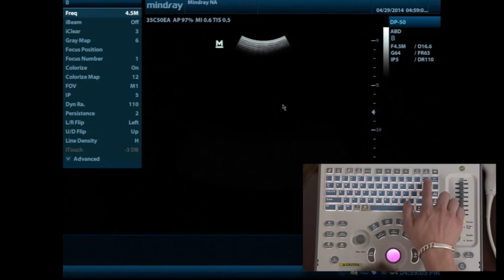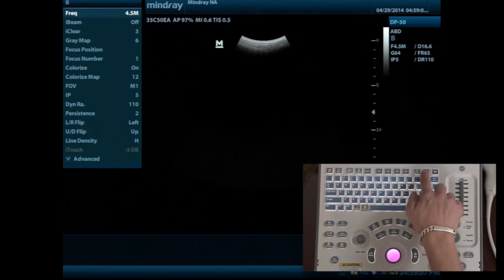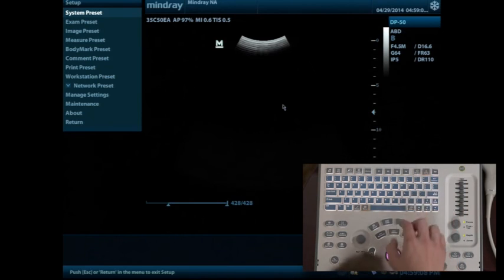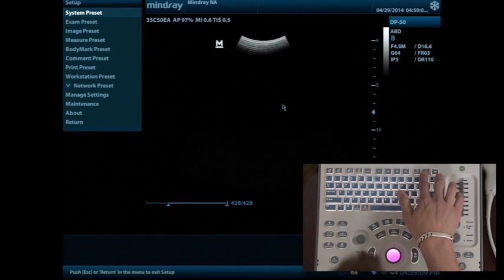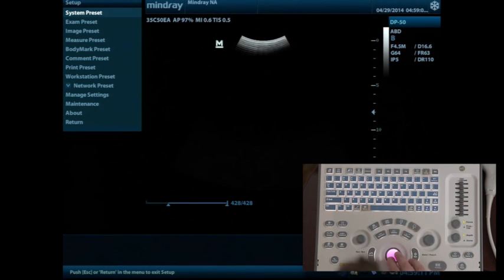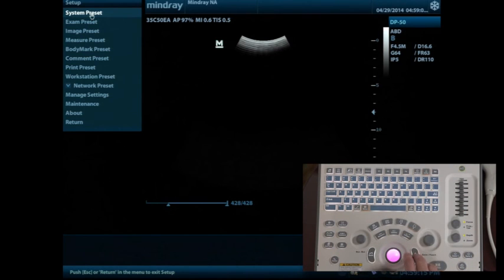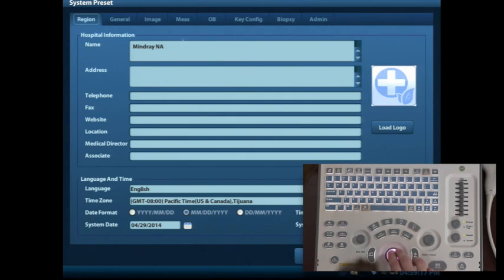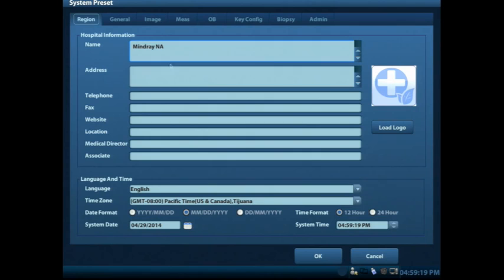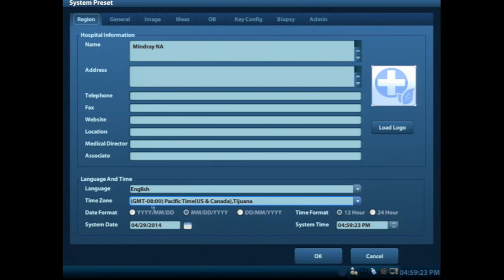From here, we're going to go up to the top of the keyboard, and we're going to press Setup. The Setup button is going to allow us to go into our back menu, where we go into our System Preset, and this is where you'll be able to type in the name of your facility, address, and telephone number. Down below is where you select the time zone that you're in along with the correct date and time.